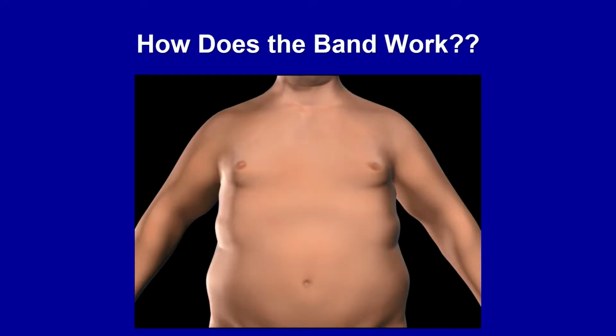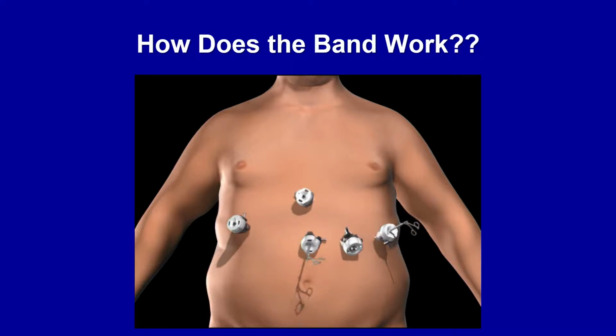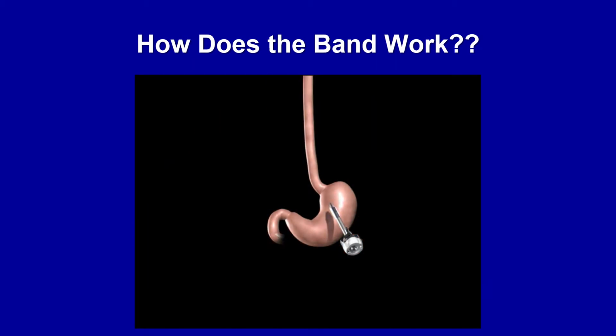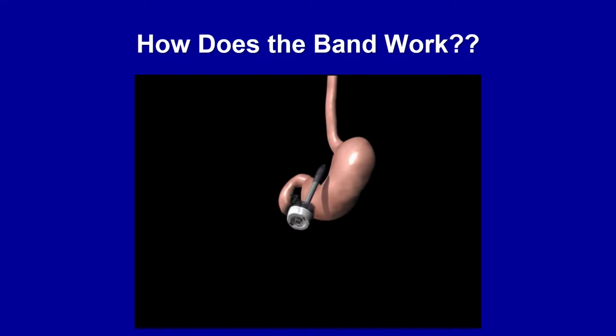We're going to talk on the next slide about how a band works. The band starts by making little tiny incisions, just like all laparoscopic surgery. This is how all laparoscopic surgery looks from the outside. We're going to go in and look at the top part of the stomach and put an inflatable inner tube around the top part of the stomach, basically to pinch the stomach down, kind of like having a tight belt around your waist. So the band is going to go in through one of the external instruments.